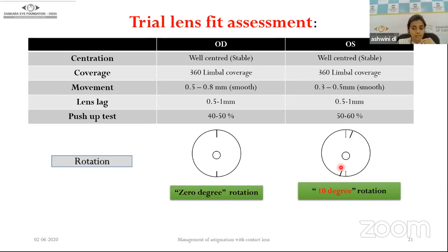As I mentioned in my earlier slide, when assessing the orientation marks, the illumination system and the observation system have to be coaxial. If there is a rotation, you can rotate the slit a little, using the protractor, to tell the amount of rotation. Using the same technique, we saw around 10 degrees of rotation present.